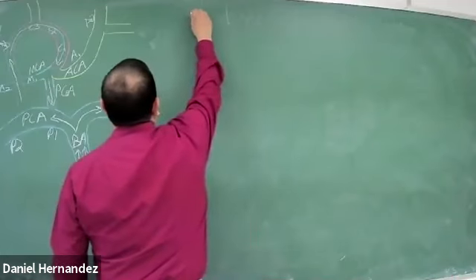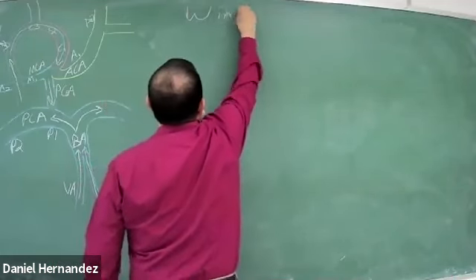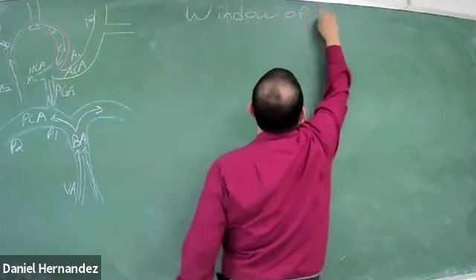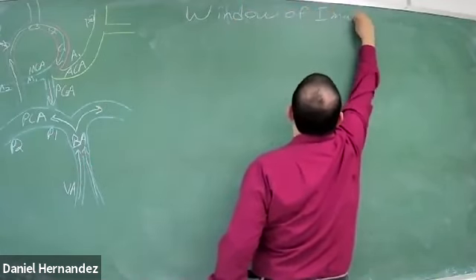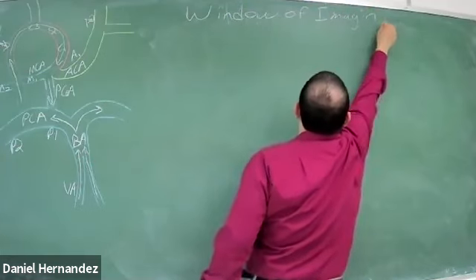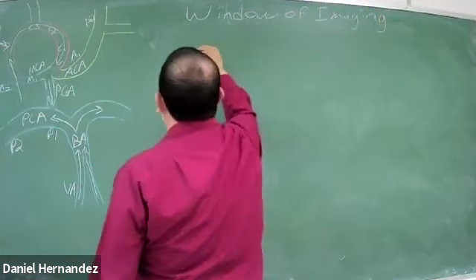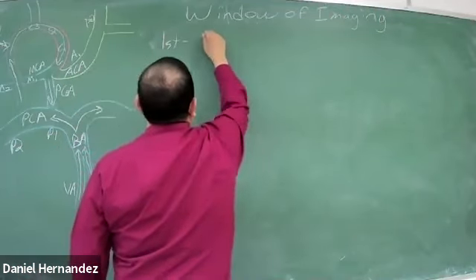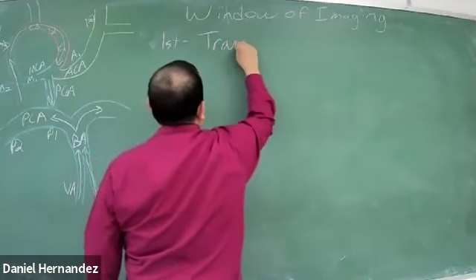So the first window is going to be transtemporal.